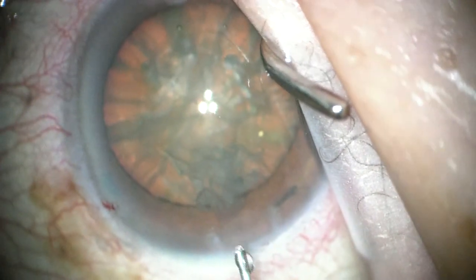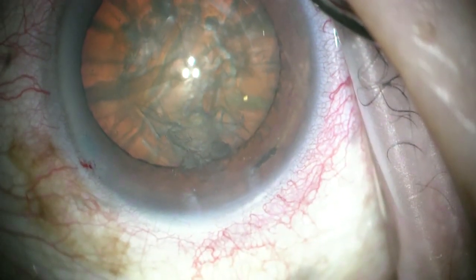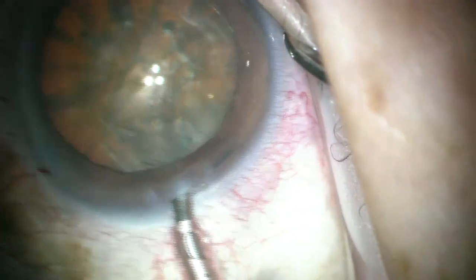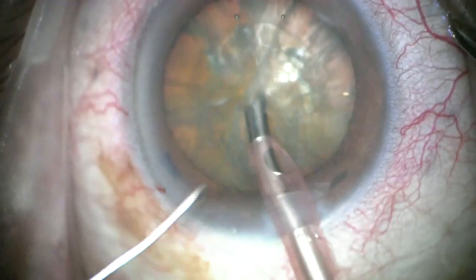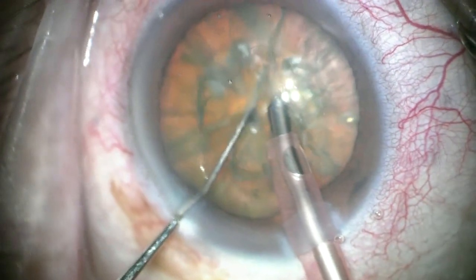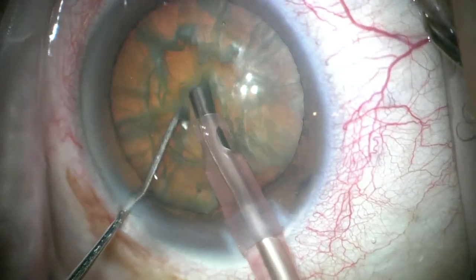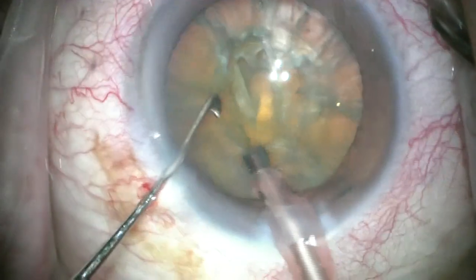The patient's head had moved a lot — we didn't have it taped down — so I had to readjust the head and then center the microscope again. Now proceeding with adding a little bit of cohesive OVD. First was dispersive, and now this bit of cohesive OVD creates a small dome over the dispersive so that lens fragments don't stick in it as much. It also gives immediate fluid flow because the cohesive OVD will aspirate quickly as you turn on irrigation-aspiration, and you don't have a block of inflow as you can with dispersive OVD, which can cause wound burn.